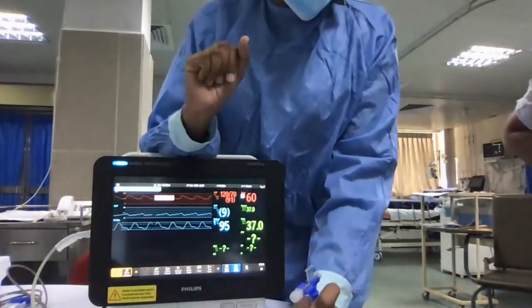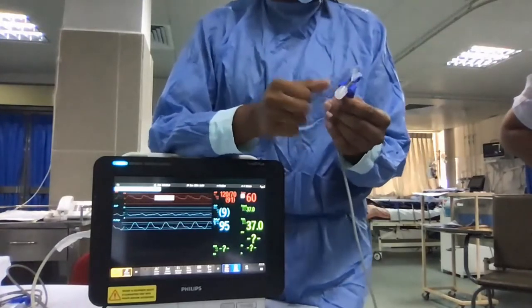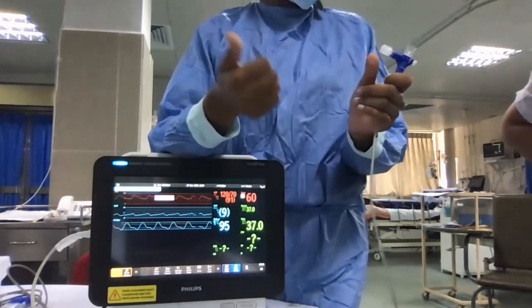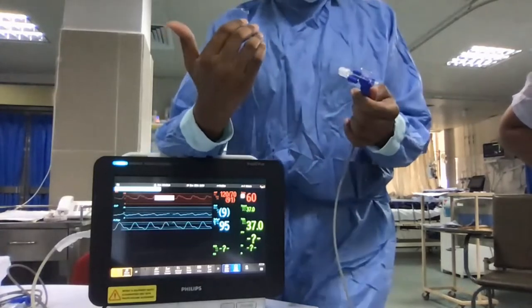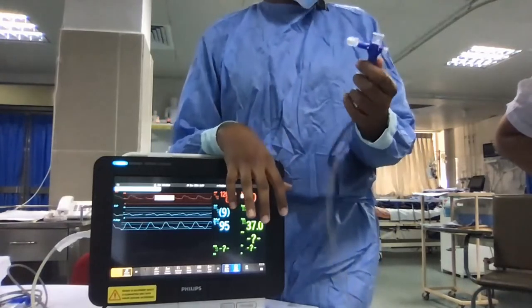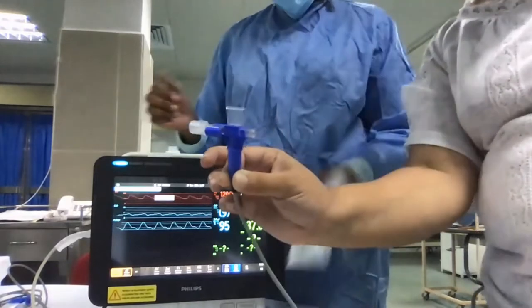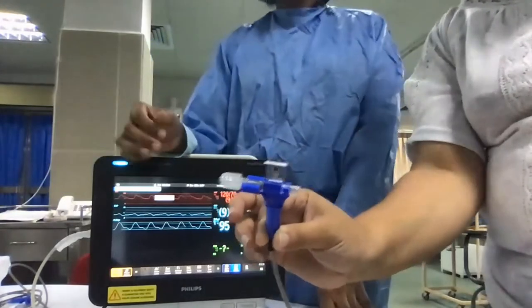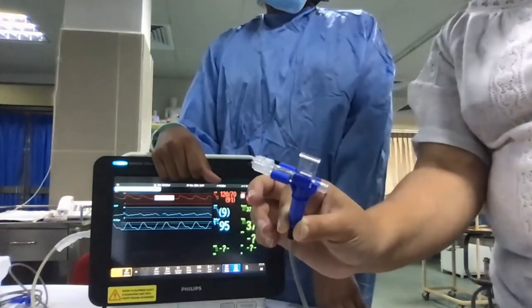There is one small restriction. When we are injecting the cold saline bolus, madam, for a small time we need to stop infusing other drugs. But I don't know how practical it is in an ICU setup. If you stop it for a small time only, you will get a more accurate reading. The other suggestion that I made, and the one that we did for the last transplant, was because we had the 3-lumen vascath, which has a brown port. So this can nicely fit into that brown port, because through the vascath we only give fluid.